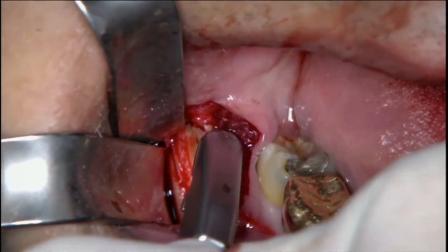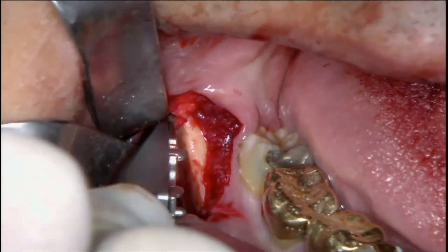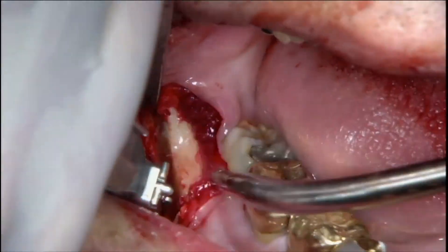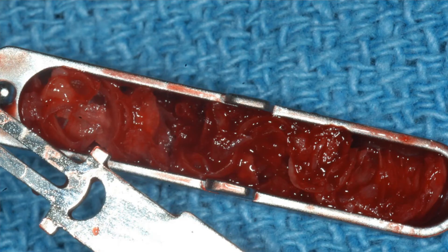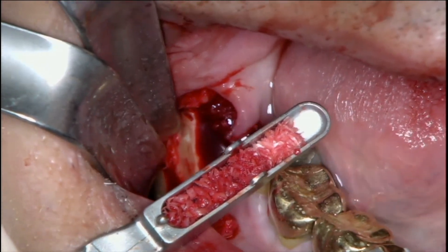One advantage of the Ebner system is that its metal composition allows me to place a lot of load on the blade during scraping, as it does not bend like the plastic disposable kind — enabling more efficient and aggressive bone harvest per scrape. With heavy load you can get bone chips, while with a lighter touch you can obtain a finer particulate size, so you can adjust the particulate size depending on how much load you place on the blade. The larger particulate size may make it easier to pack into certain surgical sites. I also appreciate that it is a reusable instrument with less plastic waste — more environmentally friendly.